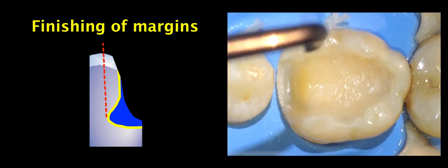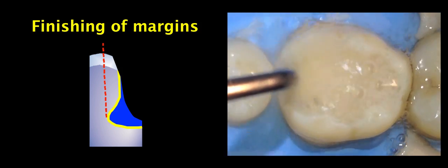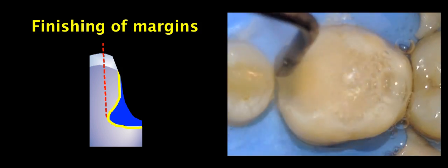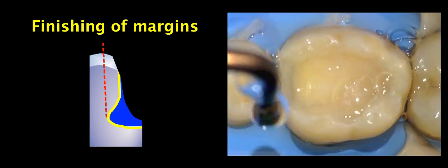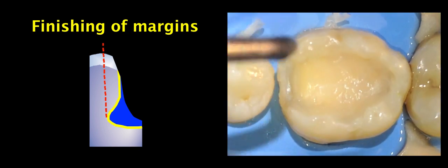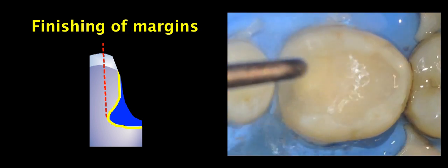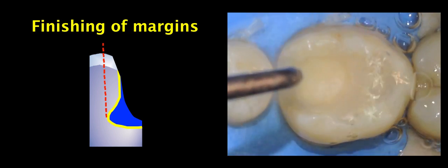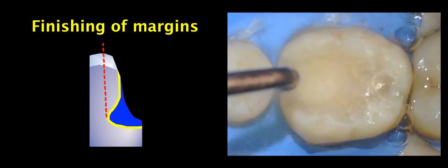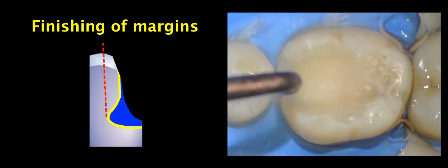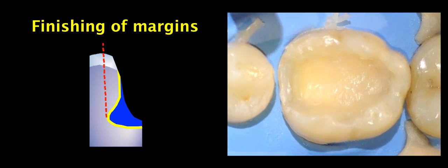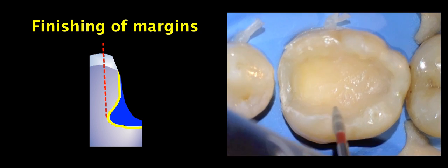We can use various materials. When we are closer to the adjacent tooth, it's very nice to use these ultrasonic instruments that have diamond coating on the side of the tooth but they're smooth to the adjacent tooth, so we can just work with them very easily and make sure 100% that we will avoid damaging the adjacent tooth. There are different sizes, larger ones for the box but also ball shaped cut in half that can do fine polishing at the corners. Because they have to be used with water, it's not very clear to see how they work in this video, but after polishing you can see how well they have polished our margin without damaging the adjacent tooth.